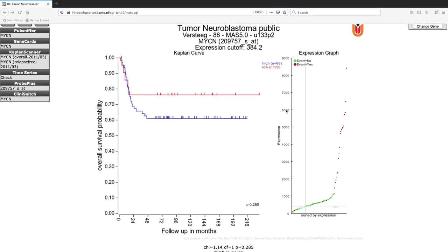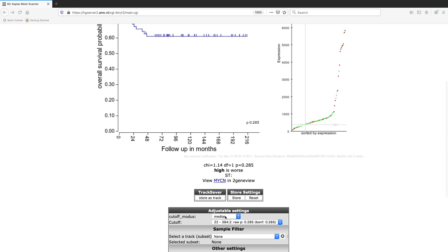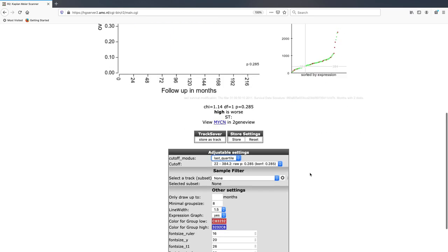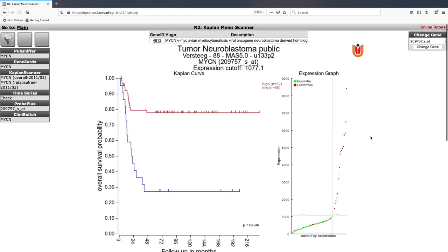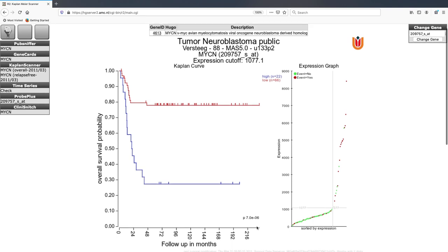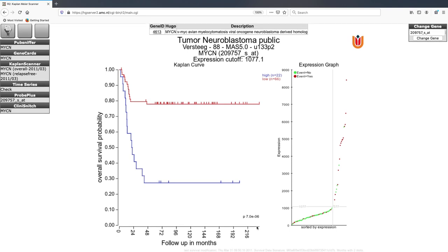You can also select the last quartile or first quartile versus the rest of the patients. Selecting the last quartile selects the highest expressing group and compares it to the rest of the patients. Again, only one p-value is supplied because we are performing only one statistical test or one group comparison.